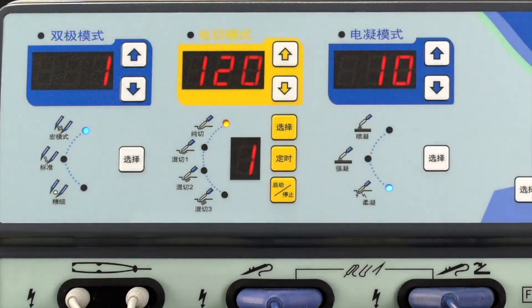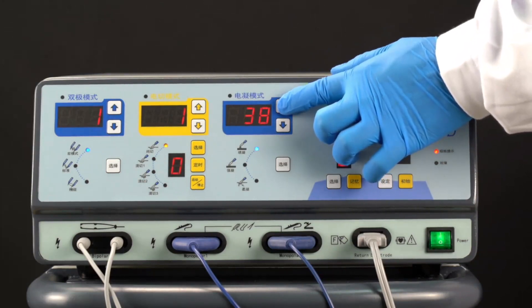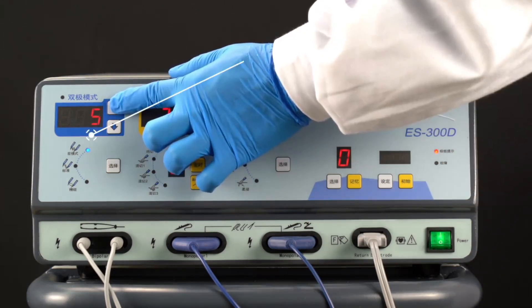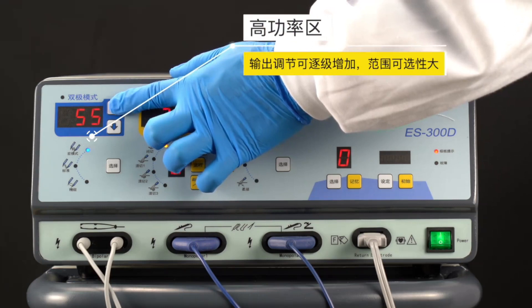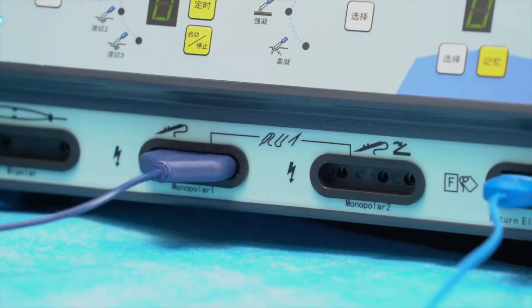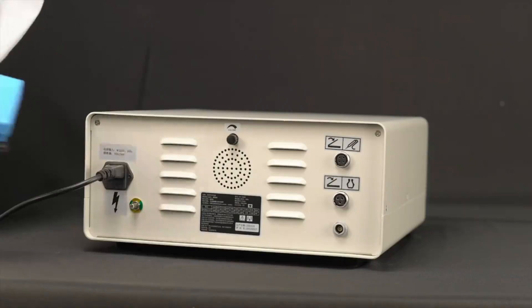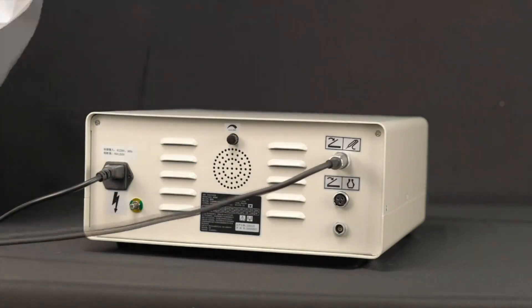The S300D adopts a digital display to quickly adjust functions and parameters through buttons and accurately display power. At low power, key conditions have high precision settings which can be used for microvascular hemostasis operations. At high power, the output adjustment can be increased step by step with a large range of options and wider applications. In the same operation, the device can be connected to two electrosurgical pencils so two doctors can cut and coagulate simultaneously. It also has a dual pedal interface, so there is no need to switch between monopolar and bipolar modes during the operation.